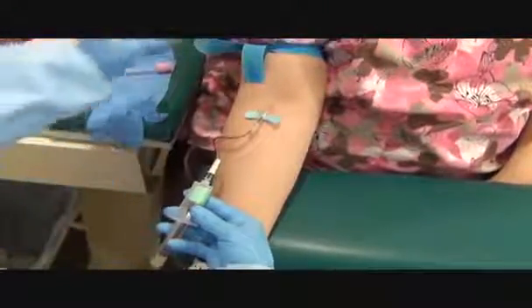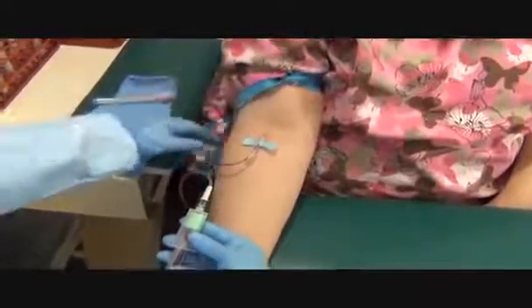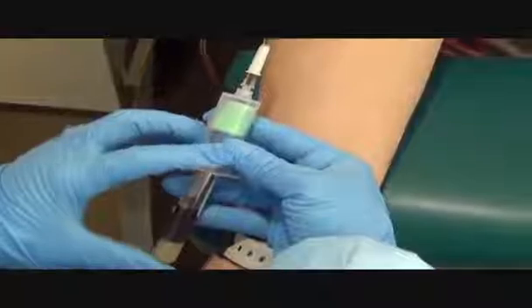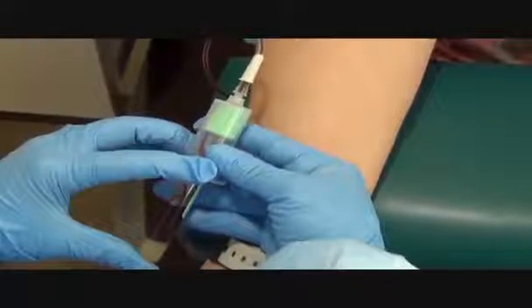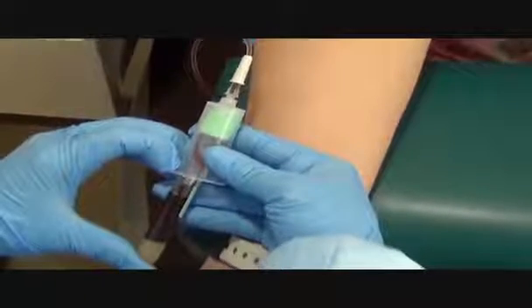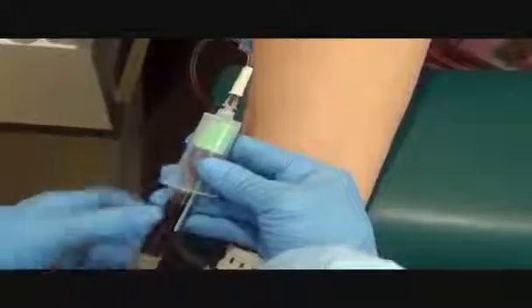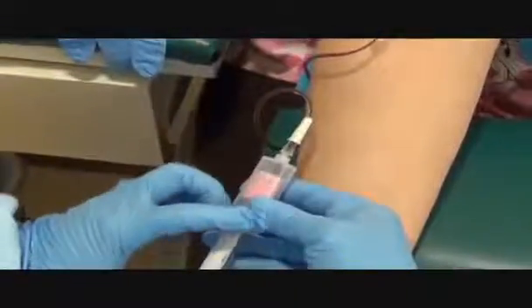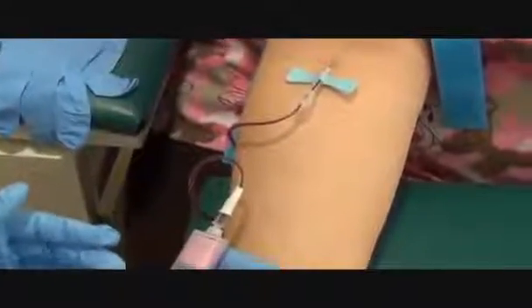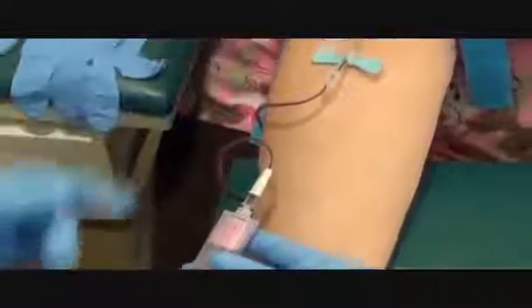Make sure that I get a good flow before I pop off the tourniquet. I'm getting a flow. I want to make sure it still fills from the bottom up so that I don't have any reflux. Pop the tourniquet. Open your hand. The butterflies are smaller so the flow is going to be slower — I just have to be patient with it. Are you doing okay? The entire time I'm drawing the blood, I want to make sure I'm aware of my tubing so I'm not pulling too far back, because if I pull too far back, I can pull the needle out of the arm.